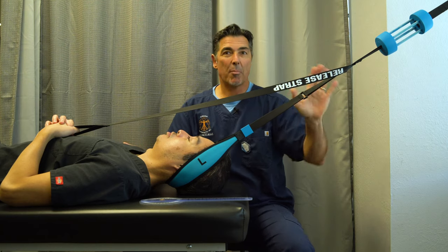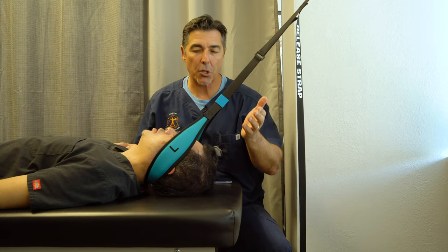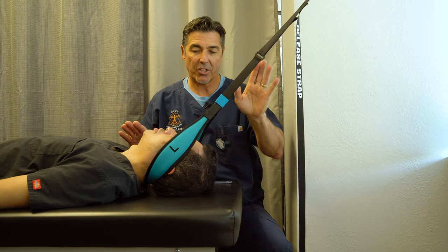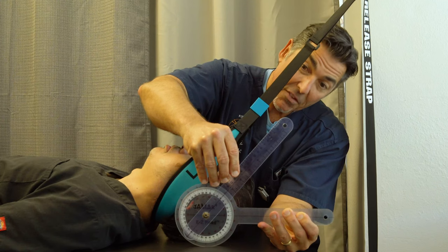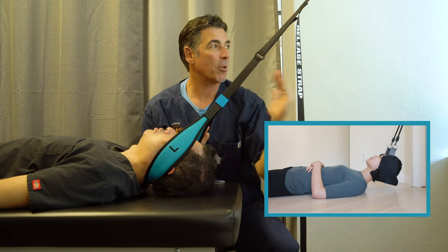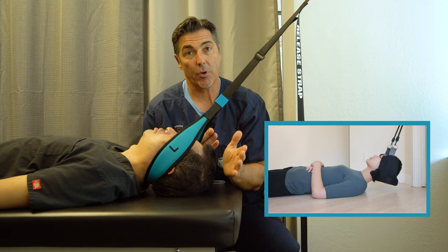Now we're going to show you what the competition looks like. We have a setup at a more extreme angle. We're not even putting Ram in traction at this extreme angle because it will hurt his neck long term — we just have it set up so you can see the difference. This angle is like 50 degrees, which is extreme. With that high of an anchor point, it gets him much closer to the door, so if someone were to open the door, it would probably hit him in the head — so it's more dangerous for an immediate reason as well.